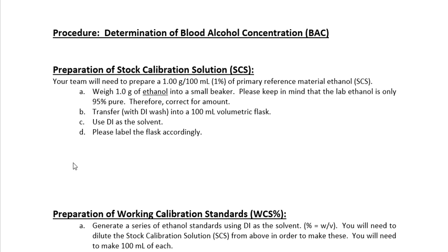Number one, you will not do this by yourself. This is kind of different than all the other labs that we've done in the ChemTech program before, right? If you look up here at the very top, it says your team will need to prepare. So your team could consist of maybe 2 or 3 people, and you're going to be working together to make a set of standards and to process a set of samples.